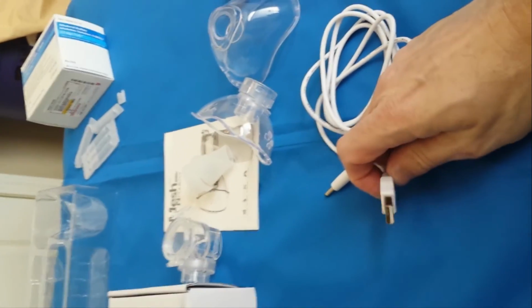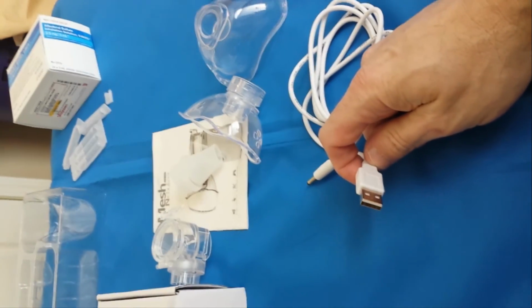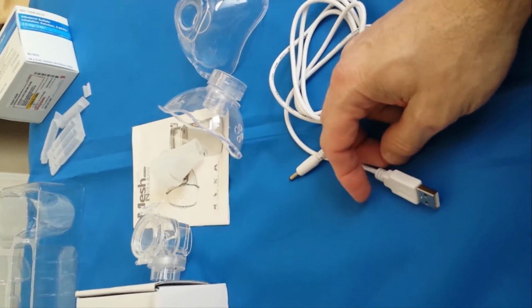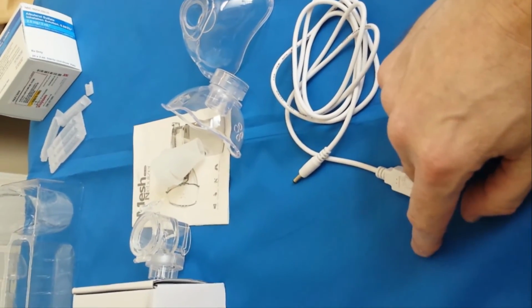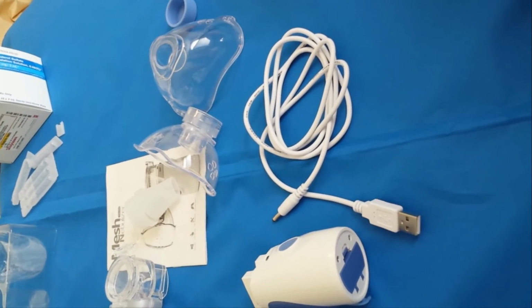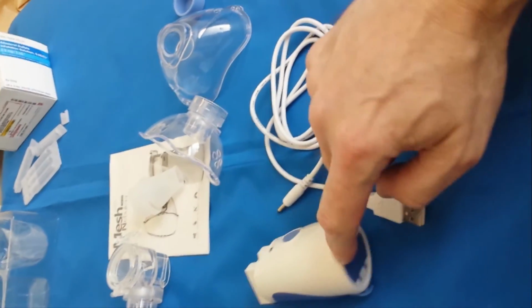It's pretty well standardized, and it'll depend a little bit on the unit that you use. A slow charger might have a little bit more trouble running the nebulizer versus one of the fast chargers. You can try a couple of different ones to find out which runs the unit best, or just use the batteries.